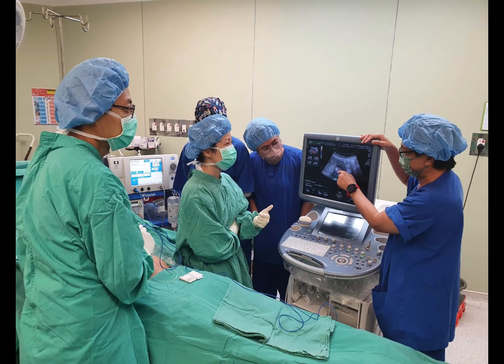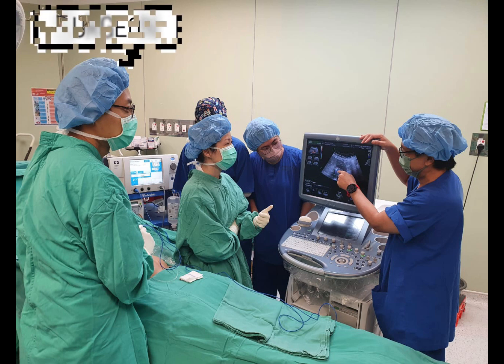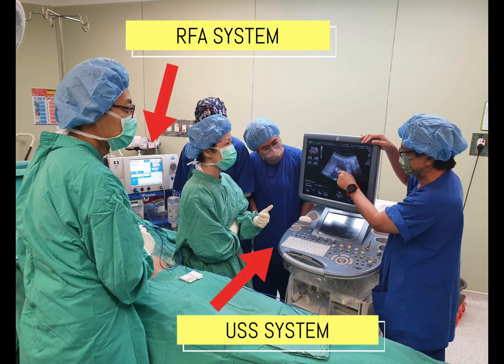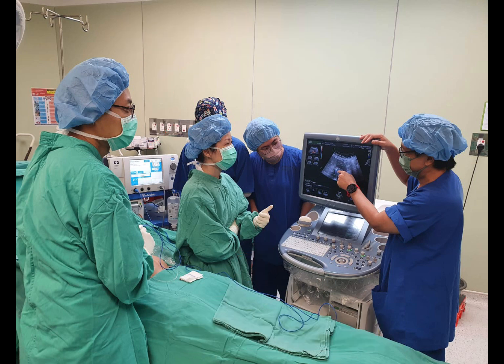This is the layout during the procedure, which can also be done under local anesthesia. The surgeon stands opposite the ultrasound system. The first assistant's role is to handle the ultrasound machine. The RFA machine can be placed next to the surgeon, but I preferred it in the opposite direction so that I can view the cycle duration and energy delivered.